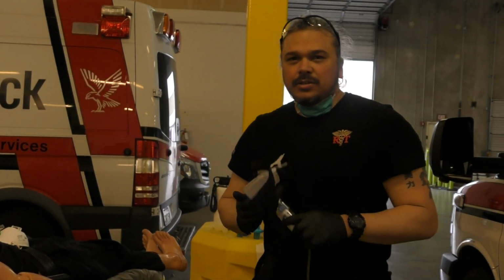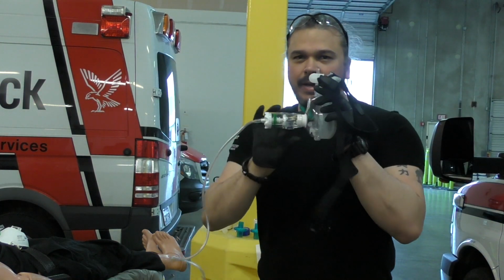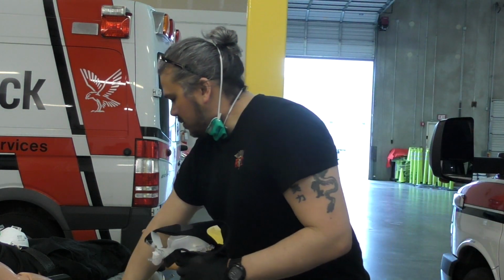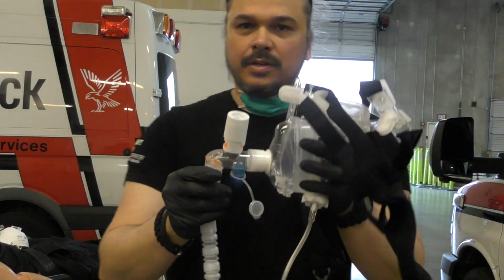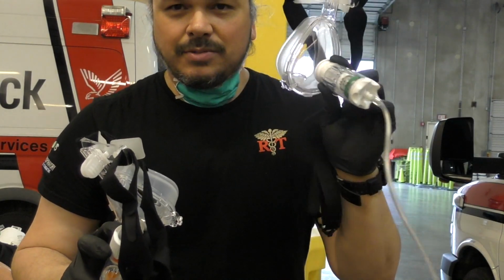All right, I'm going to show you how to do a couple different respiratory barriers when you're using this type of mask, a kind of medic CPAP. This one's the GoPAP, okay? We also have another version of it, this one. These are meant to be worn, saves a lot of intubations, really good stuff.